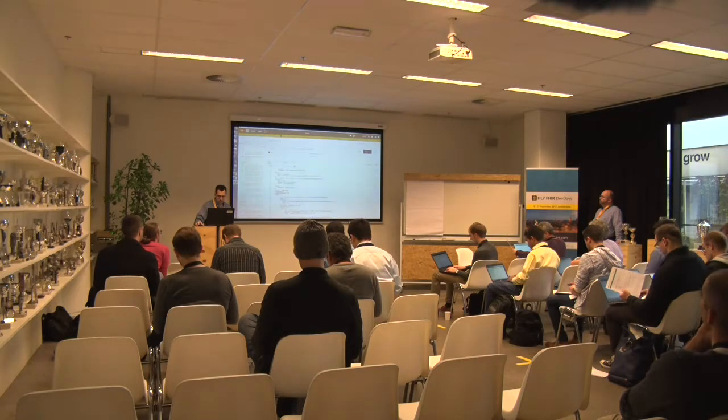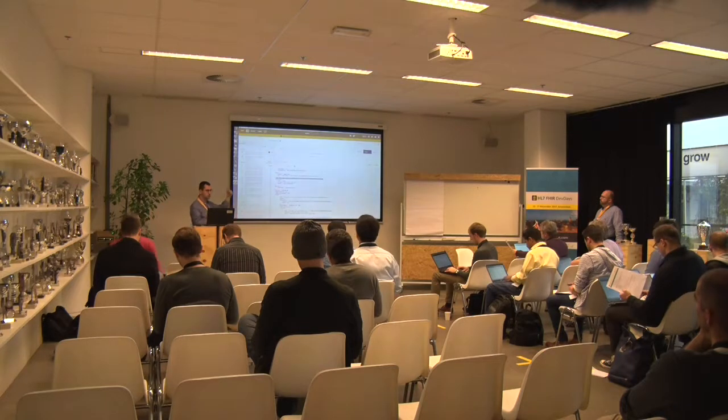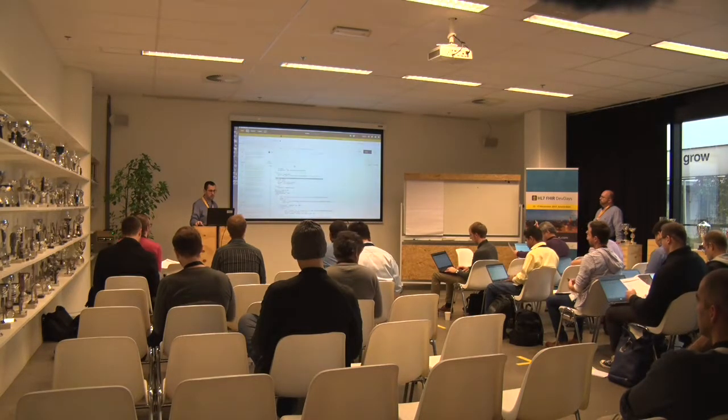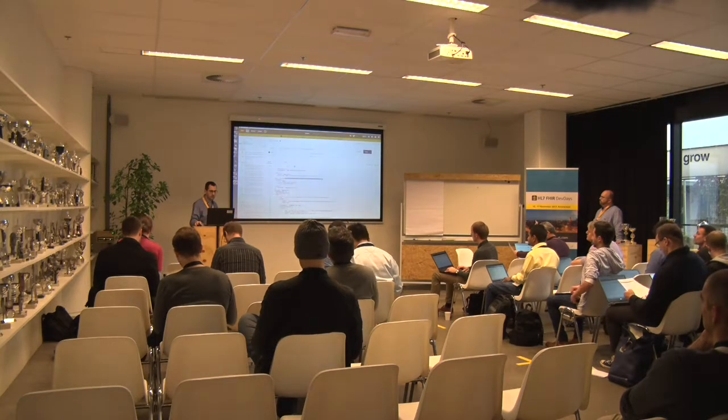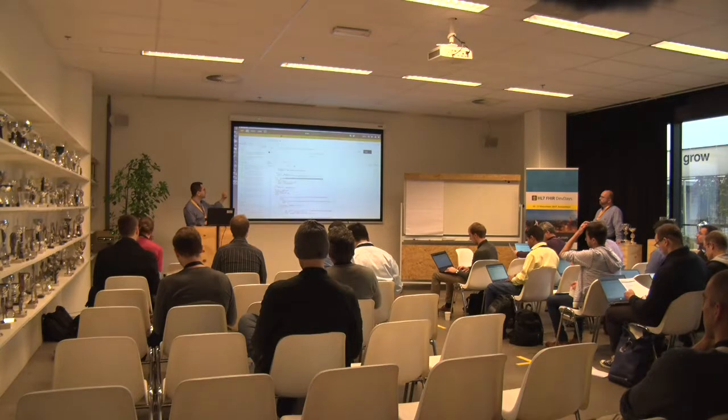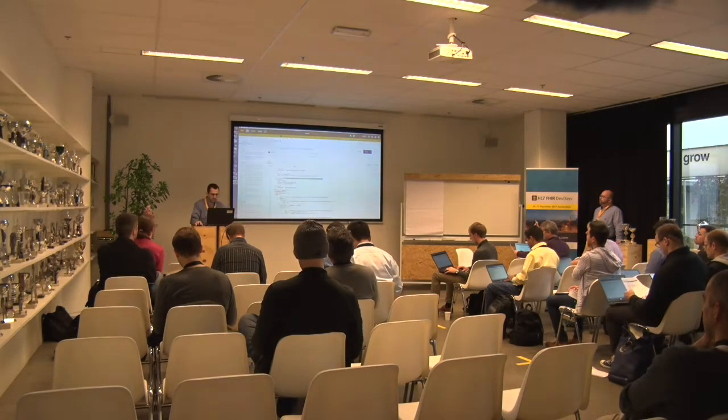Let's go down. There is the study UID. So for those of you who are going to try and follow along, if you want to construct the URL, you will want just this part of it, just where the numbers begin. Okay? You don't want the prefix. You don't want the part that says URN OID.